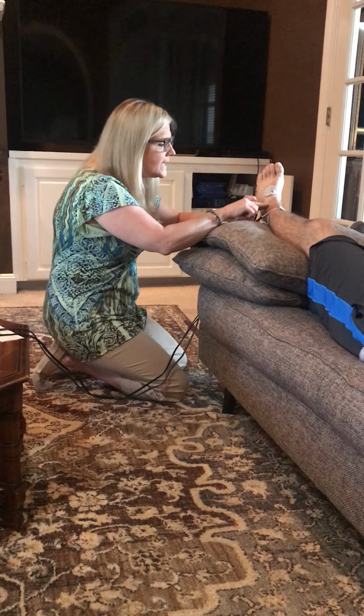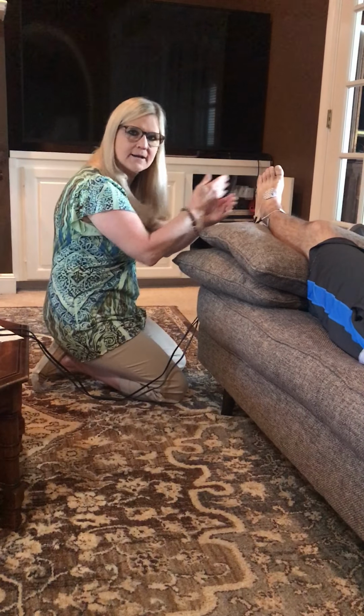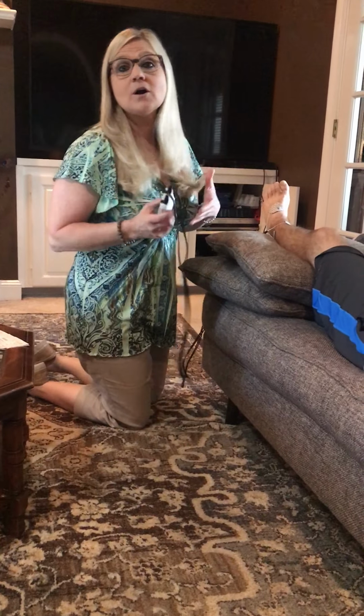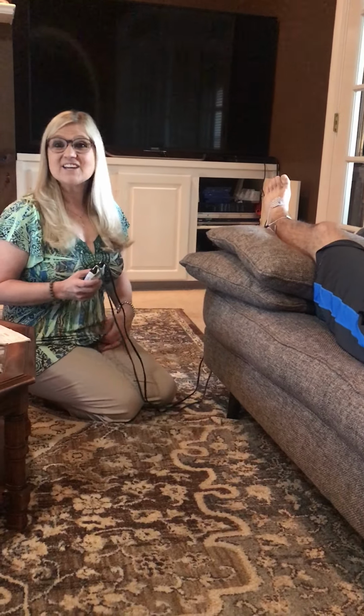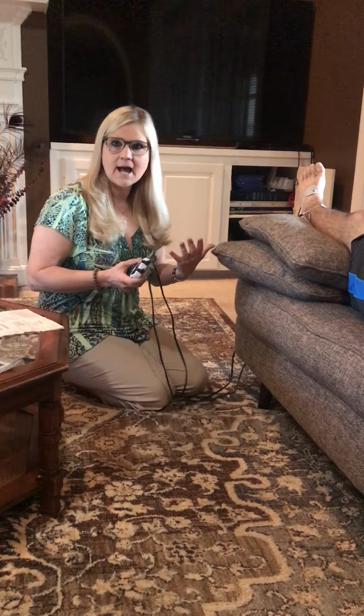If he could pinpoint the specific area, then I could take off the scan and just crisscross right on top of that. All right, so I have set this up on program 3 for this specific machine, which actually sweeps through the frequency of 1 to 150 from low rate to high rate.